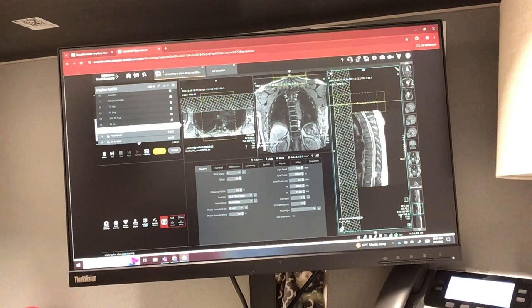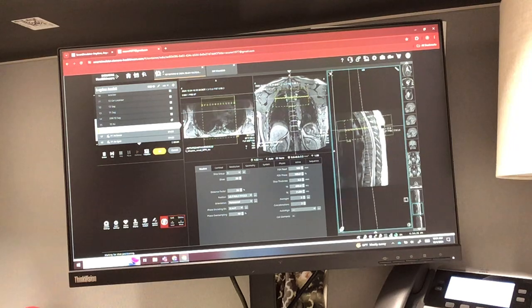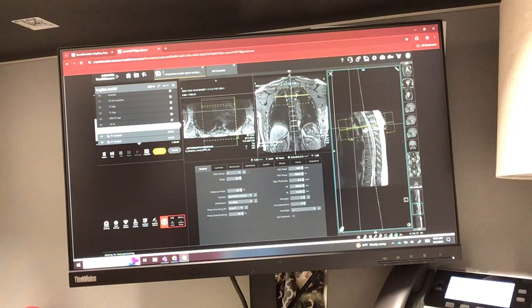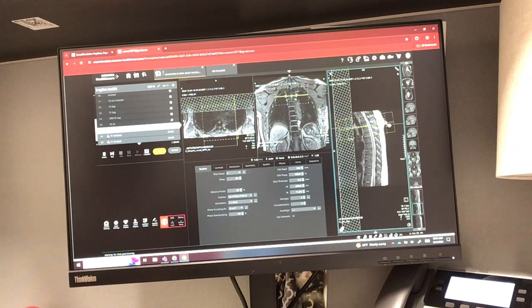So we know these are all our thoracic vertebrae, and that starts with T1, because that's how we set up our field of view to begin with, setting up that sagittal. So if I'm looking at this, it's telling me to do a T1 axial upper stack to cover T1 vertebrae through T8 vertebrae. So here's my T1. I'm okay with this field of view. It ends back here. This is my phase oversampling. I'm not cutting out any spinous process at all.